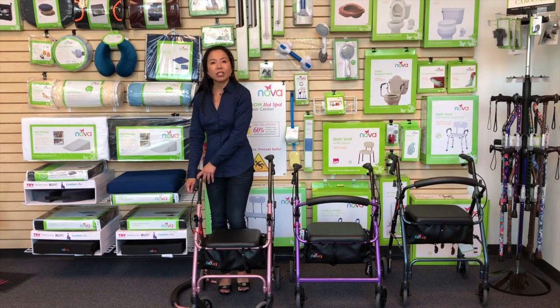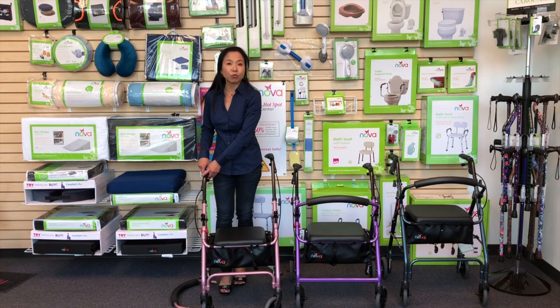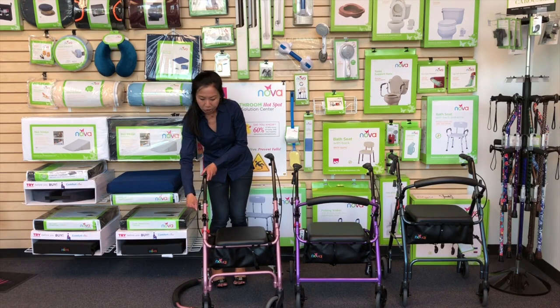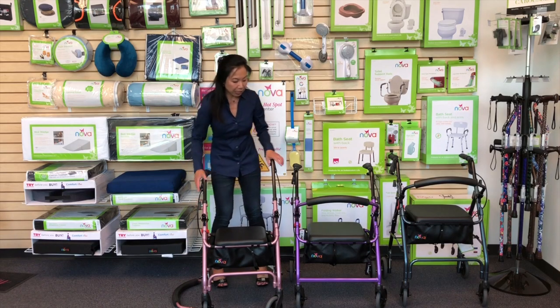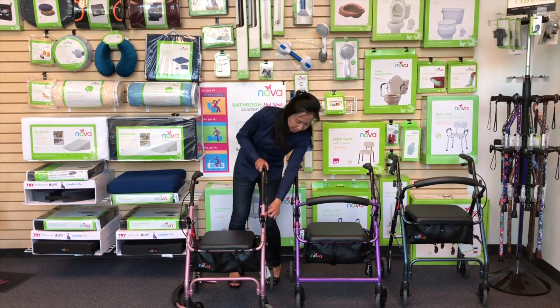What I recommend is adjusting the handle to your wrist. That way, when you have your hand on the hand grip, you have a nice 30-degree bend in your elbow. It's a good starting point. All right, so go ahead and thread the adjustment star knob all the way through to the other end. And you'll feel it tighten up, and make sure it's nice and tight. And you're gonna adjust the other side the exact same way to the exact same height as the other side. All right.